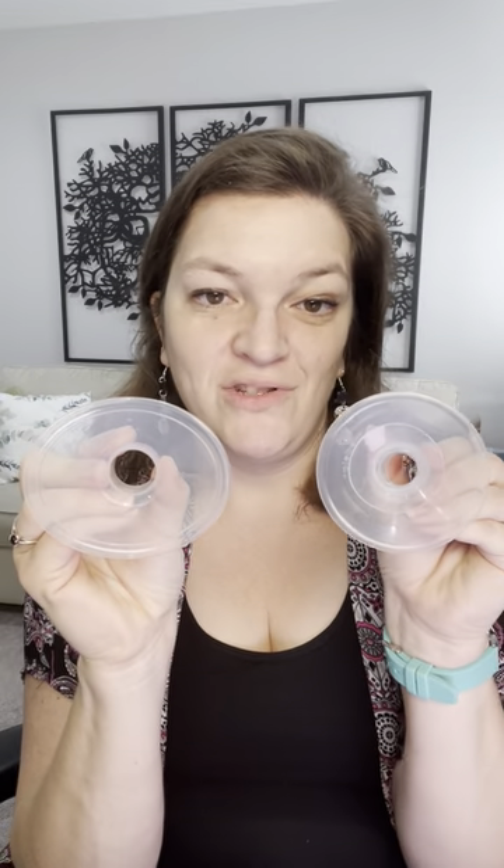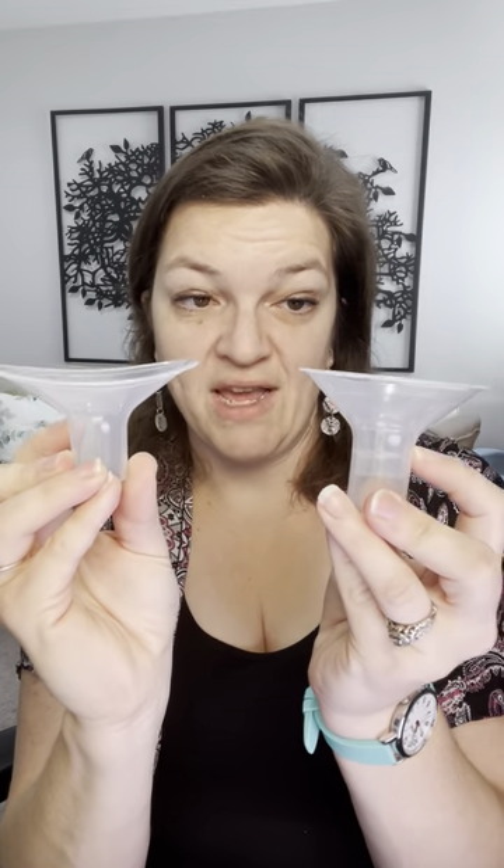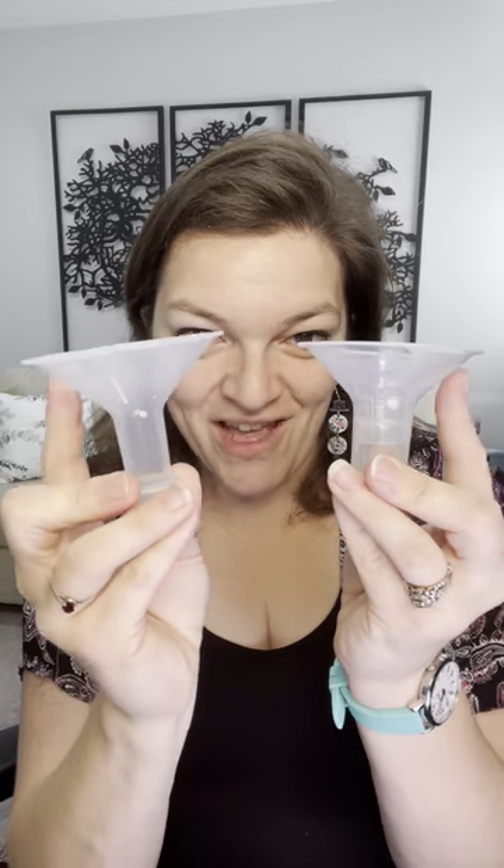So if you're using a 19 insert on a Medela 24, the circle flange is going to look slightly different than the oval flange. You can make both of these shrink down to a 19 millimeter diameter, but how they approach the breast is going to be completely different. You can see this one does a little bit more of a soft cup, whereas this is more of a straight cup.